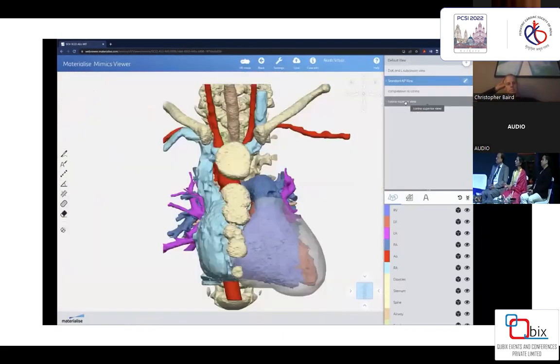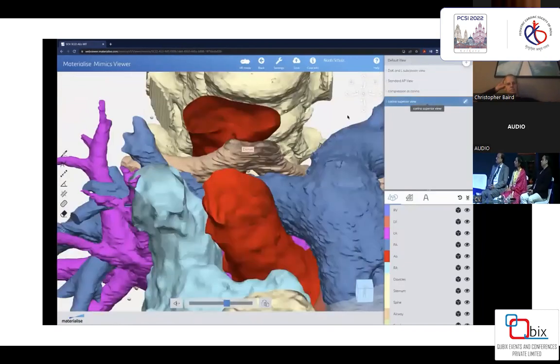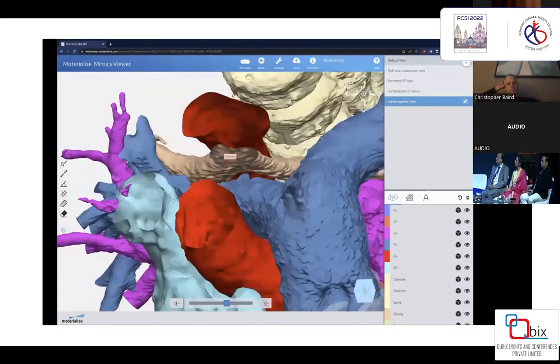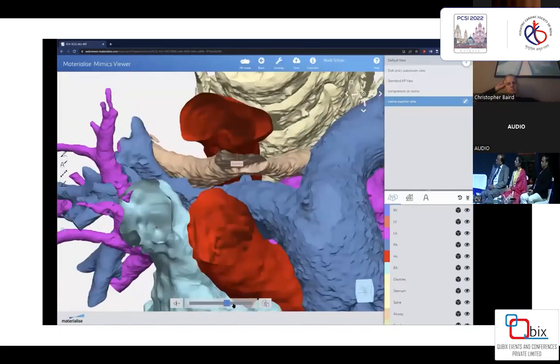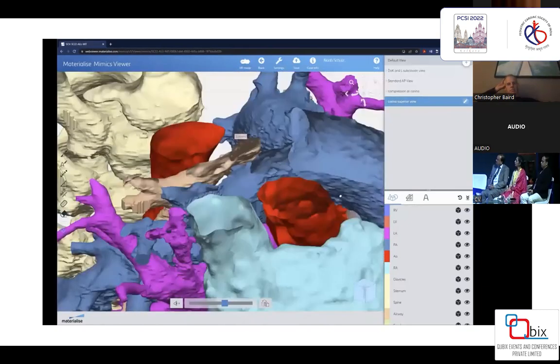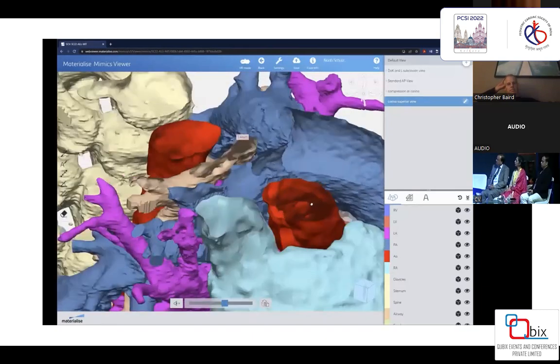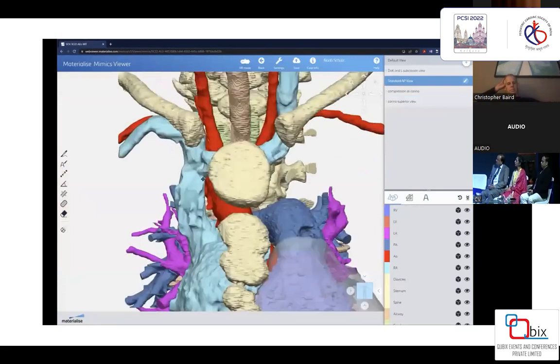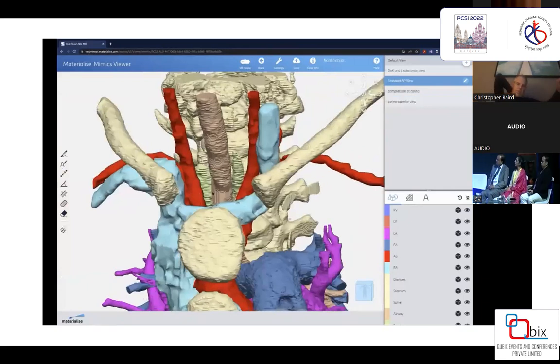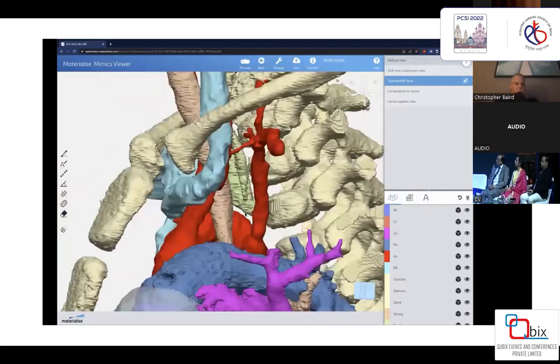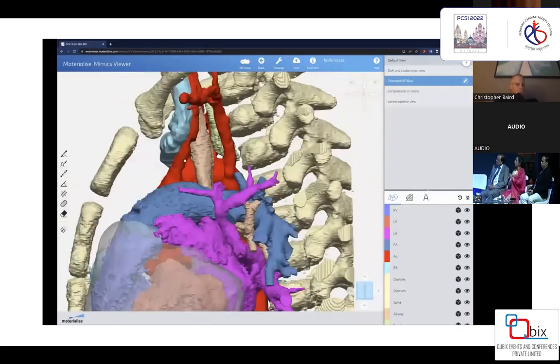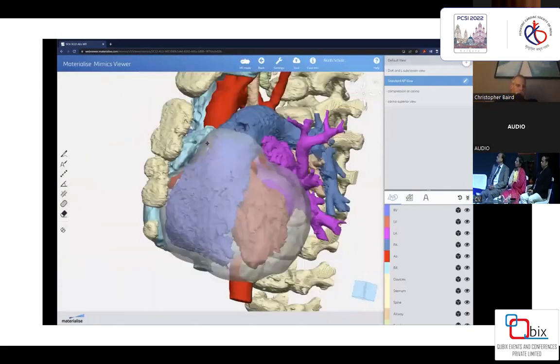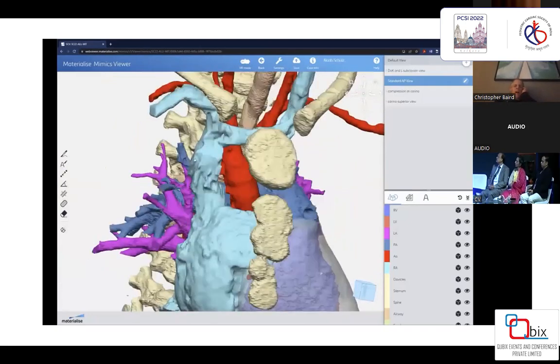These models are shared with clinical teams and used intraoperatively by surgeons to make measurements or create views difficult to reproduce using axial imaging alone. We can look at the cross-sectional view of the trachea and move the cut plane to interrogate the relationship between the PA in blue, the aorta in red, and the airway in light brown. These models are limited to what's visible in CT or MRI imaging — the esophagus, for example, is invisible in its most compressed state, which is one limitation of image-based modeling.